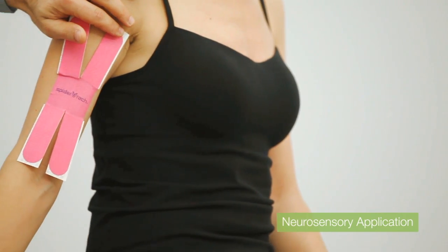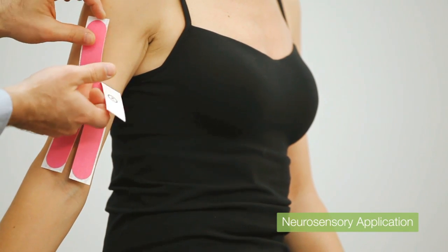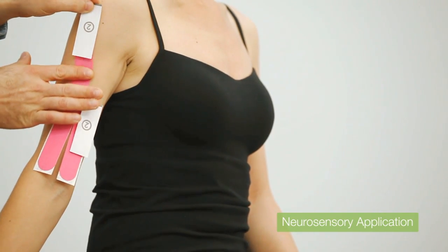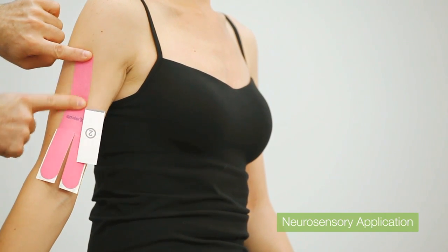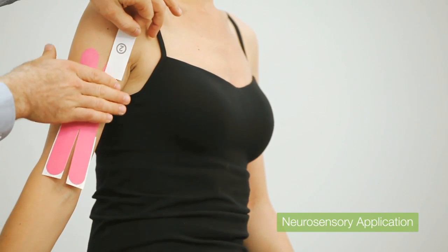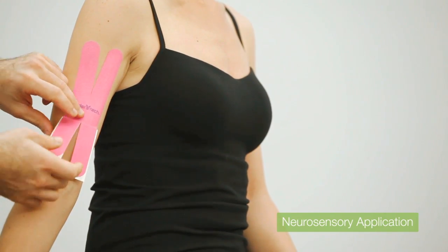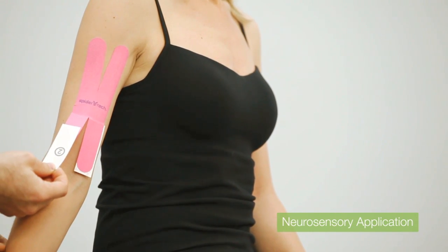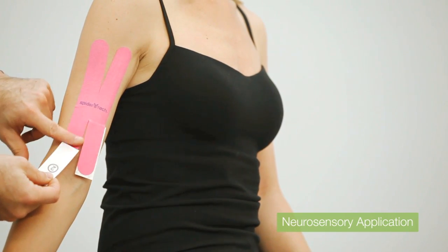Then I want to stretch the tissue underneath the tape within the patient's pain-free range of motion. From there, I start to remove the backing of the tape, relieve any stretch or tension on the tape, and gently lay it down in contact with the skin, waiting until about 90% is applied, and then remove the backing completely. I rub over top of each section before moving on to the next one. I proceed to do that for all four projections. Remember: neurosensory applications are where I'm stretching the tissue and not the tape, relieving any tension on the tape and laying it down in contact with the skin.